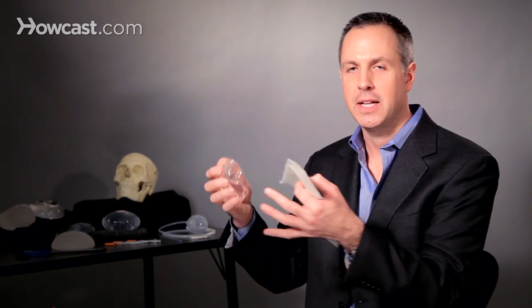At this point, the nurse will commonly open the implant packaging to the surgeon. The surgeon will take the implant out of the packaging. This is the only time that the implant is touching anything other than the inside of the packaging and the inside of the body.